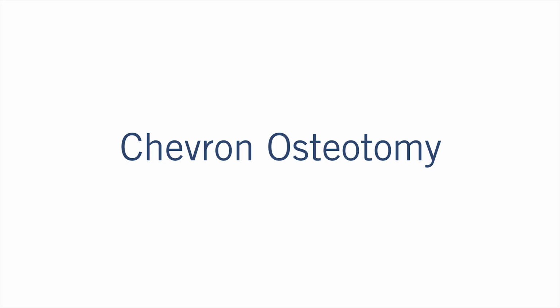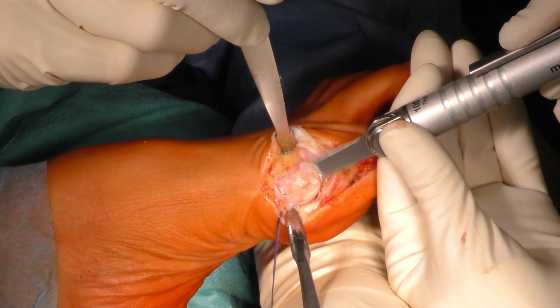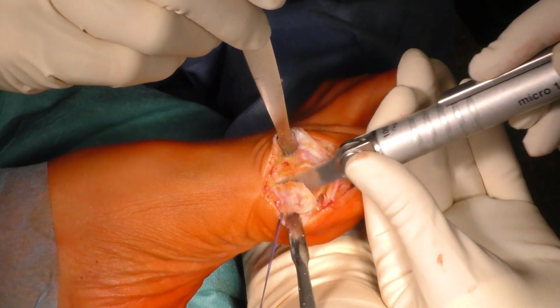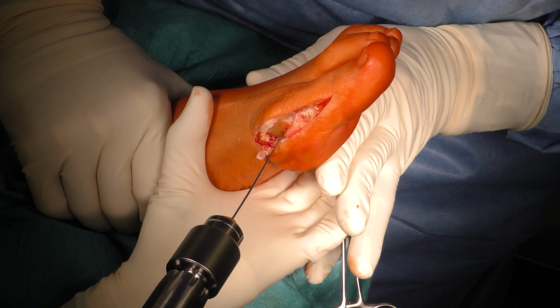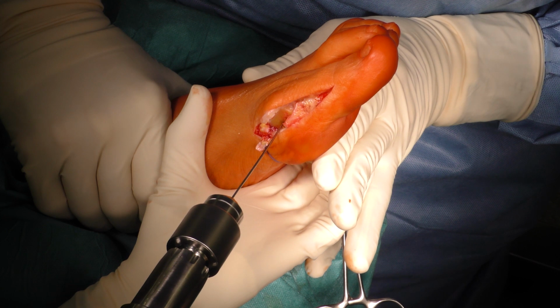Chevron osteotomy. A prominent pseudoexostosis is removed. Care is taken not to damage the sesamoid glide area. A K-wire is inserted in transition from upper to middle third of the metatarsal height, just dorsal to the center of the metatarsal head.